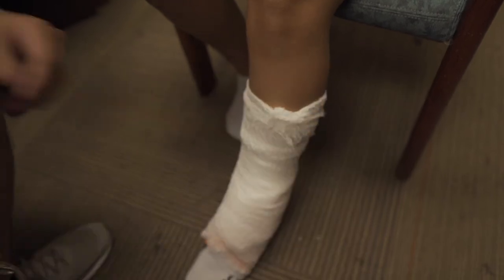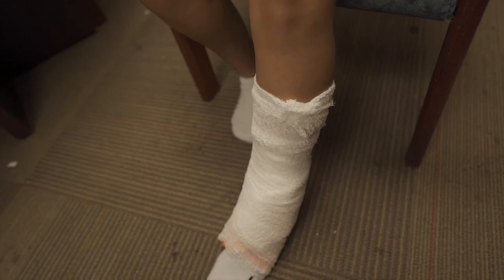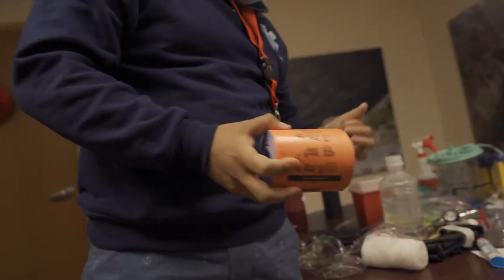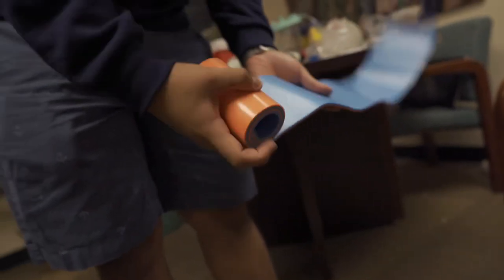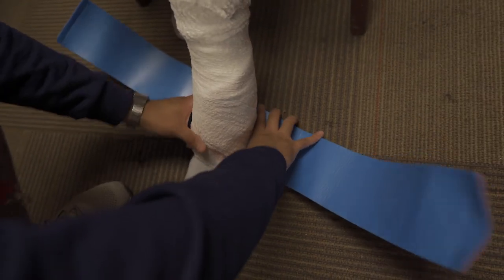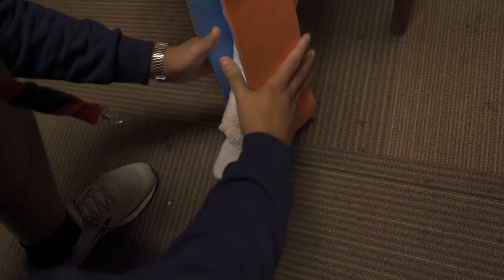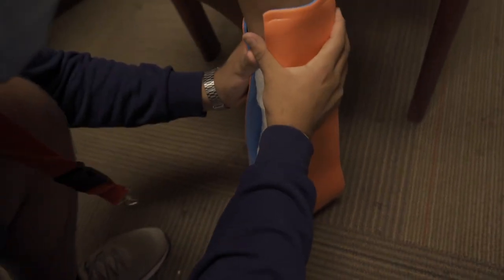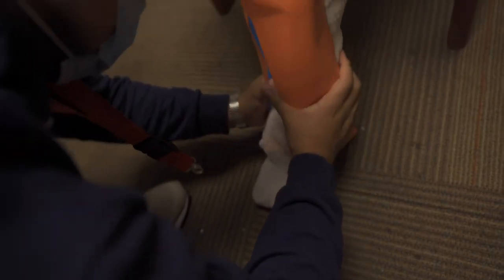Grab the second Sam splint and get it out of its packaging. With this second one, unravel it completely as well. Place it in the same area you placed it originally for the foot. This one is just going to support everything on the side — right in the center. Feed it up the sides and create a C-curve on the sides of the leg to support the leg. You're splinting the foot to the leg now.